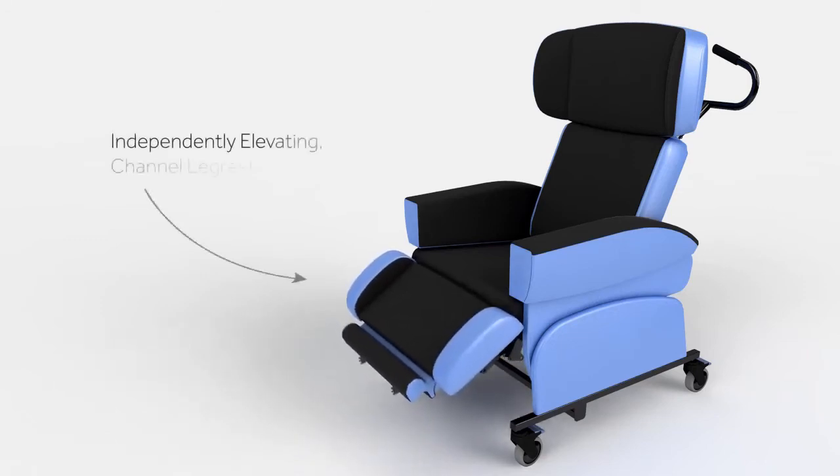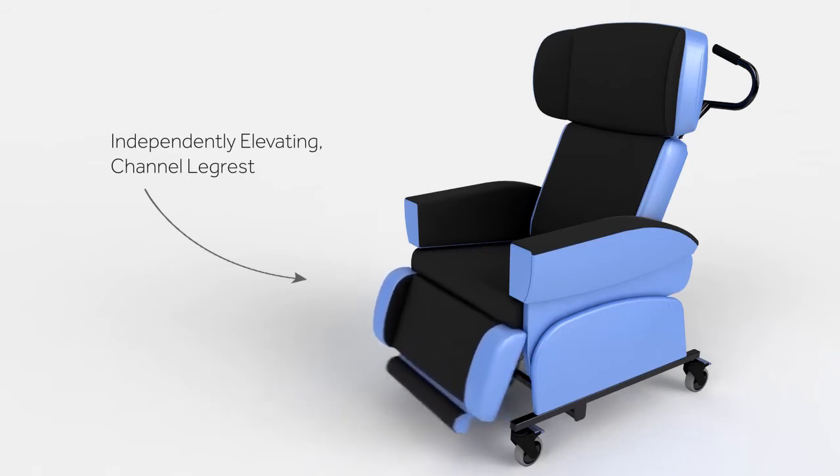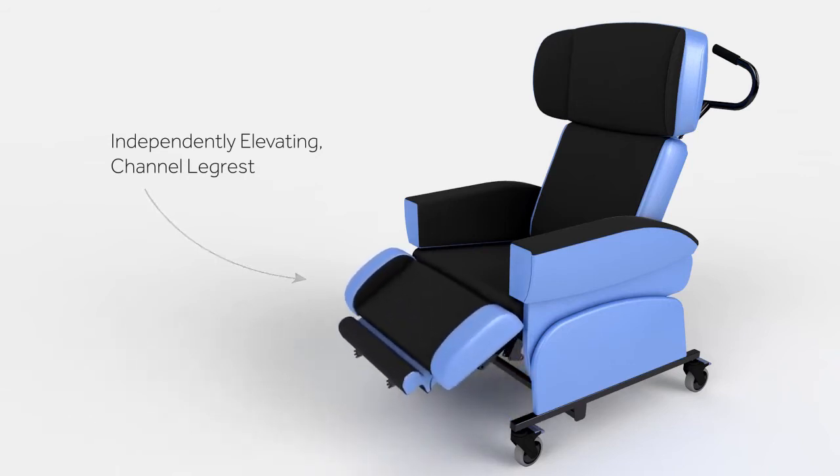An articulating leg rest with integral footplate provides a comfortable leg position. It can help to reduce lower leg swelling and stabilise posture by lifting the legs above hip level.